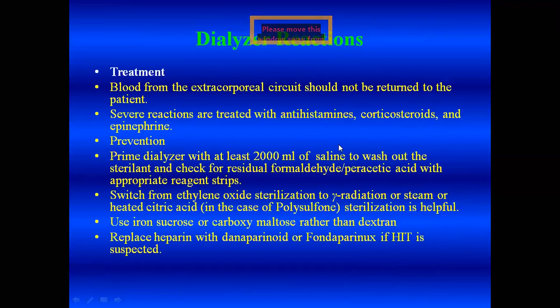How do we treat? The most important part is, do not return the blood from the extracorporeal circuit to the patient if you suspect a dialyzer reaction. Treat severe reactions with corticosteroids and, importantly, epinephrine.